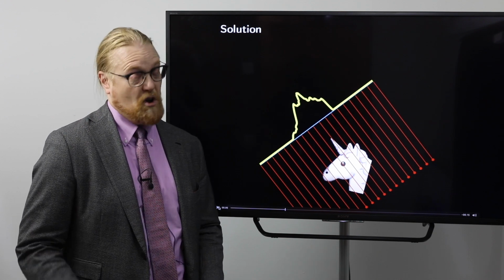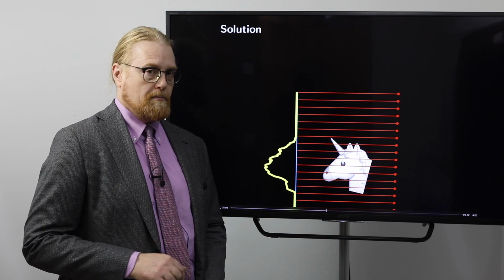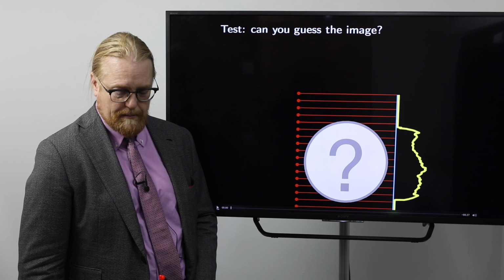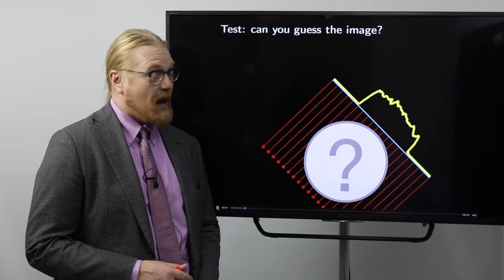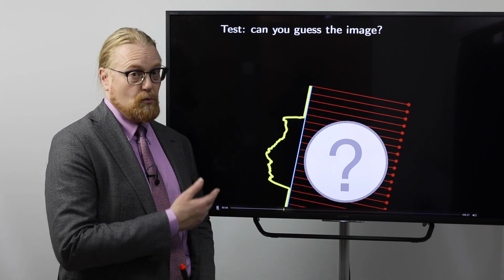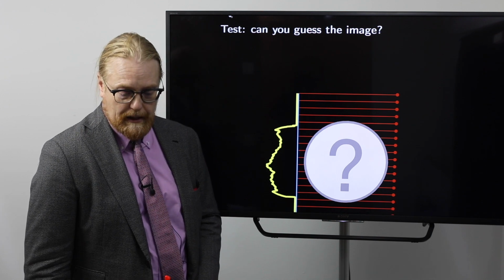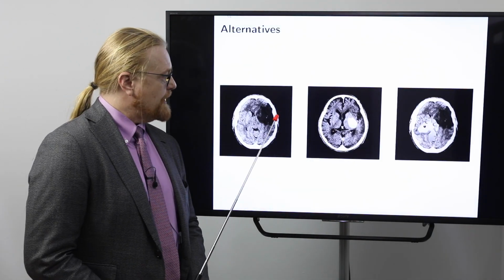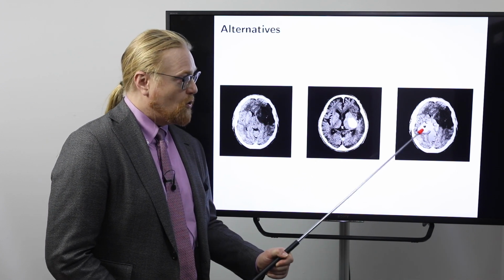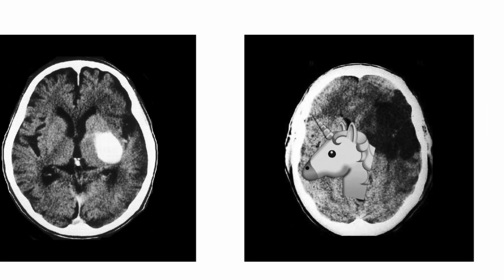But really it's not very obvious, I would say. It's really hard. And now we get to the final and most difficult mystery of all. This is a medical one, not a written character anymore. What could it be? At least to me it looks pretty incomprehensible. It's one of these. It's either ischemic stroke, hemorrhage, or a rare but serious condition called unicornism.